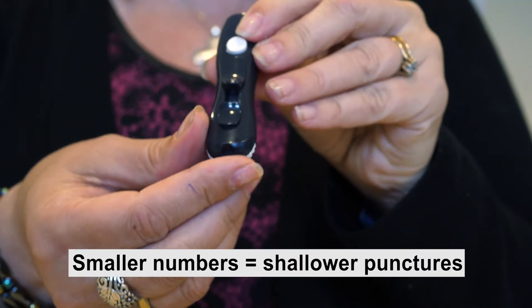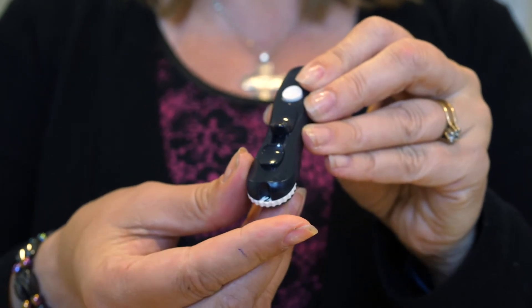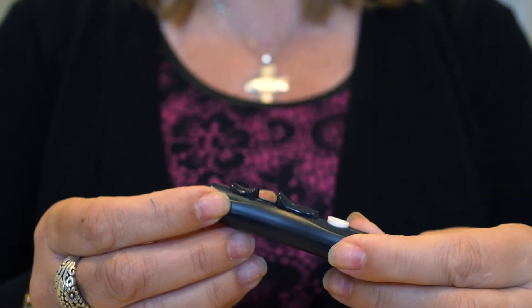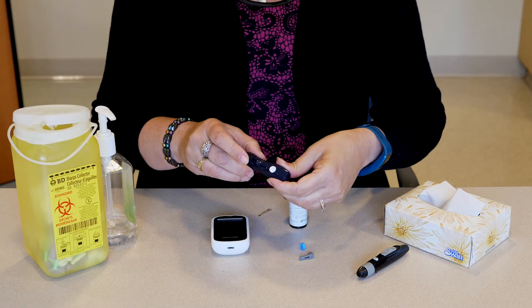Smaller numbers are for shallower punctures. You may want to start at a shallower puncture and increase the depth if you cannot obtain a sufficient blood sample. You may need to load the lancing device by pressing or sliding the control button until you hear a click.